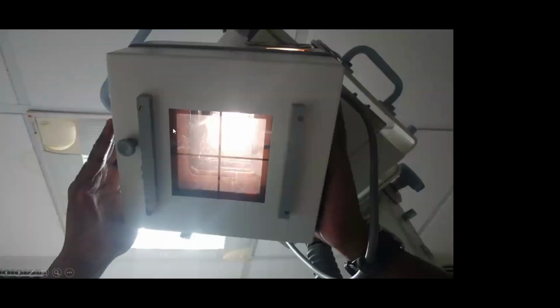This is how the X-ray beam window, from where it comes, looks like. It has horizontal and vertical lines which will get projected on the baby's chest whenever we are centralizing or positioning it. See to it that this X-ray unit is not oblique and is in sync with the tilt of the bed. So for example, if the bed is tilted to around 15 or 30 degrees, this also should be tilted to 15 or 30 degrees. If you can't do it, then it's better to keep the bed flat during the time of X-ray.